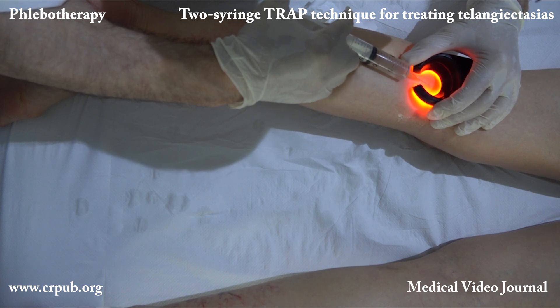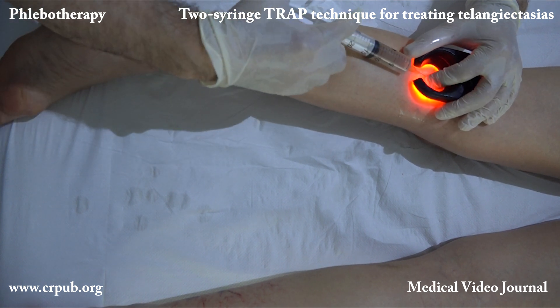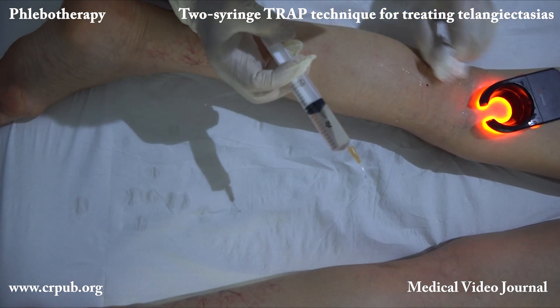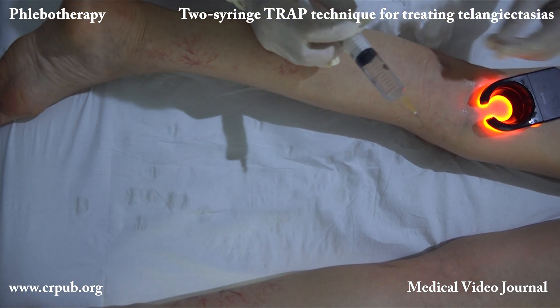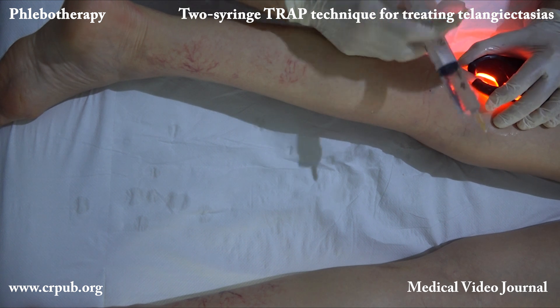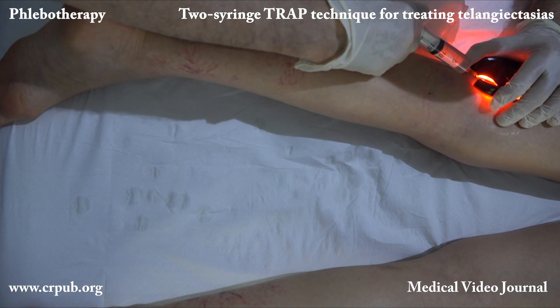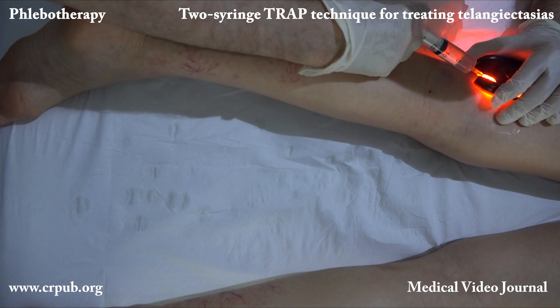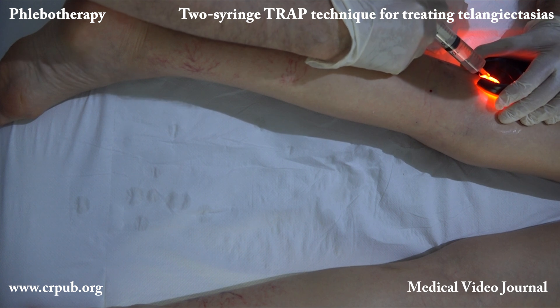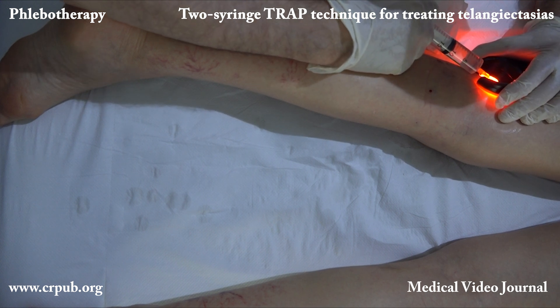In TRAP, the ectatic capillaries are injected, just as venules, reticular veins, truncula, and perforating veins are injected. Indeed, there is no pathogenetic difference between a large varix and an ectatic capillary.